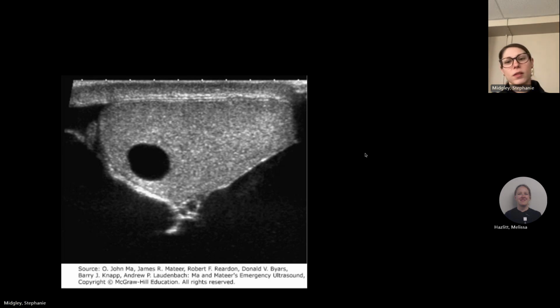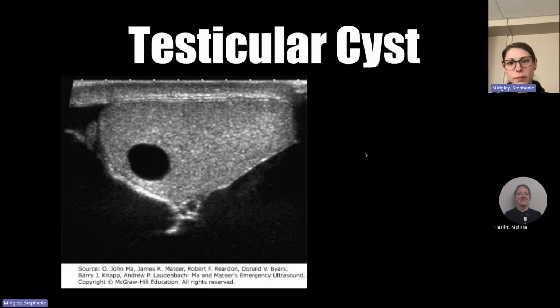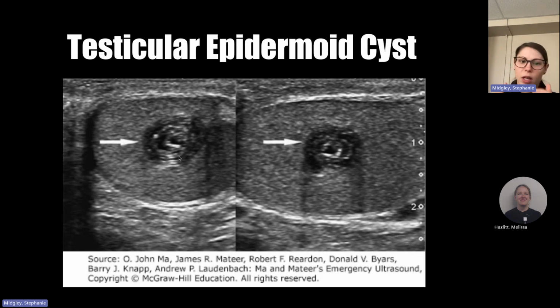What's this one? Cyst. Yep. This one's a little bit harder. This is your epidermoid cyst. So basically it gives you this onion ring looking thing. A well-circumscribed lesion with different layers within it, with alternating hyper and hypoechoic rings.